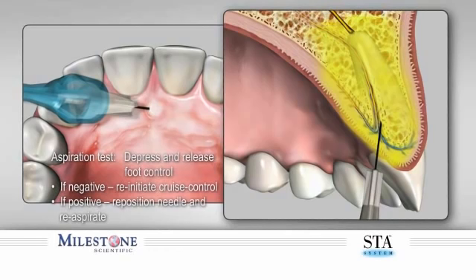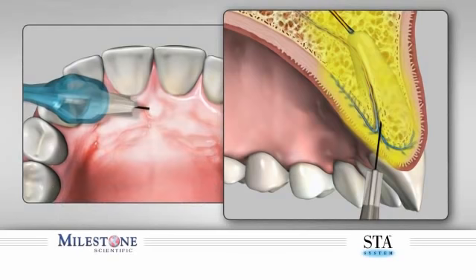If there was a positive aspiration, as determined by observing blood in the hub or tubing, reposition the needle and then re-aspirate before continuing. After you have delivered the proper amount of anesthetic, you will notice diffuse blanching of the tissue. Once a suggested volume of anesthetic solution is dispensed, the needle will be removed.